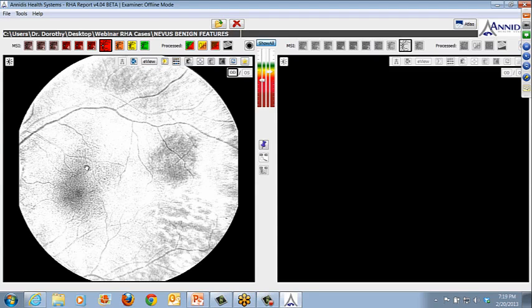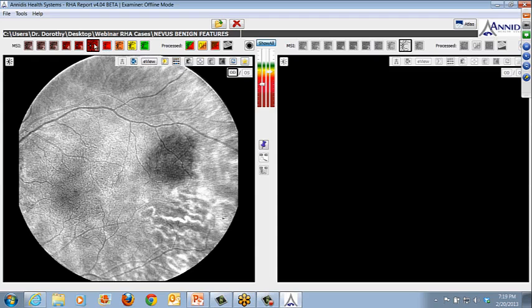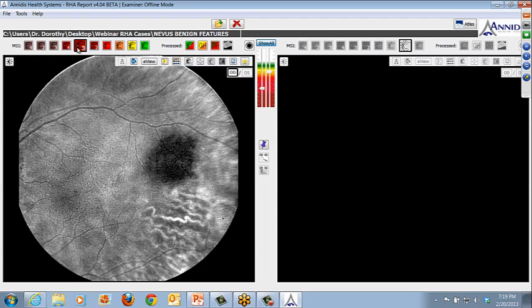So choroidal nevi are going to start to become visible as you get closer to the choroid, as you can imagine. And as you get sub-RPE, they're going to be nicely highlighted here. And in this particular case, all of the principles of following a lesion still apply. The lesion is evenly pigmented. It has even borders.